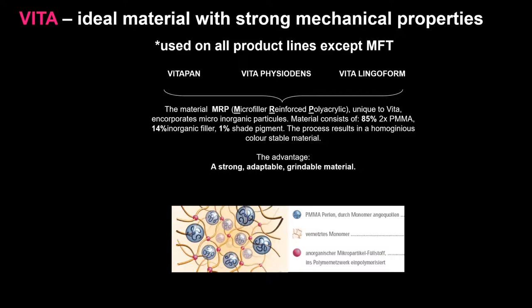Why do I like acrylic glass? And why do I like the product? Number one, it's hard. Number two, it has characteristics of enamel because it has glass in it. You have to watch when you flame it because you'll burn it, because it has a lower burning temperature than straight polymethyl methacrylate denture teeth. But it allows me to grind and alter the tooth as required without having to repolish it. And that's really important. We have to polish IPN again.